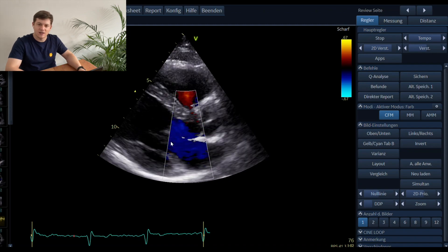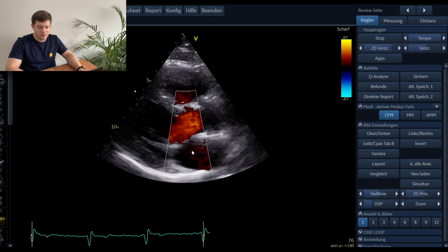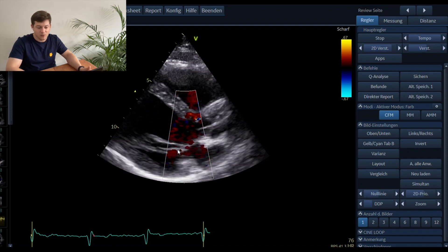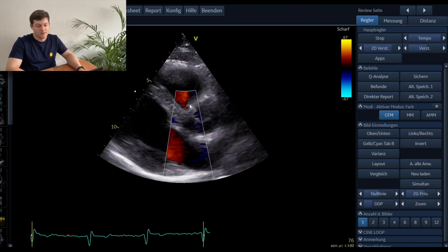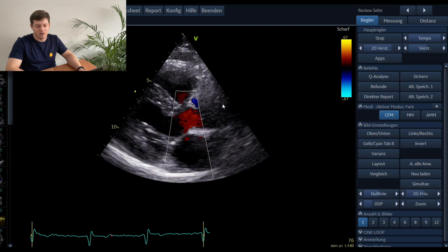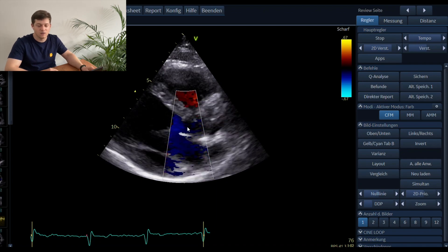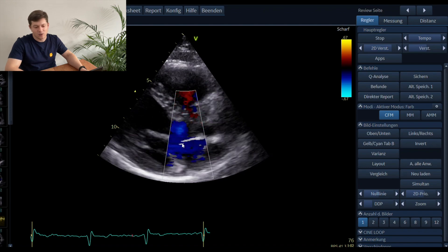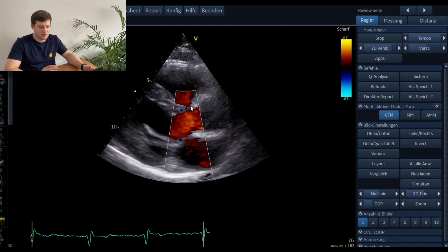Placing the color Doppler over both valves at once is used frequently in daily clinical practice, but keep in mind this is not that accurate overall — you basically should not do that. You should place the color Doppler first on the mitral valve to detect any kind of mitral vegetation or mitral stenosis, and afterwards over the aortic valve to detect stenosis or regurgitation. Otherwise you could miss important information.